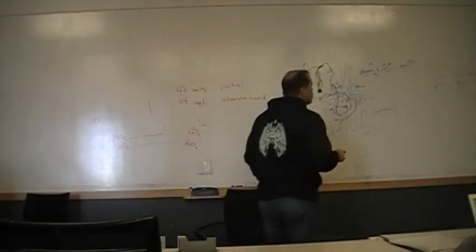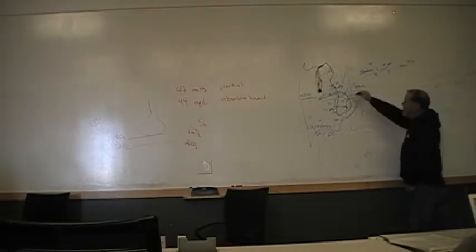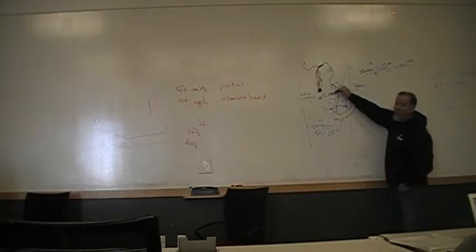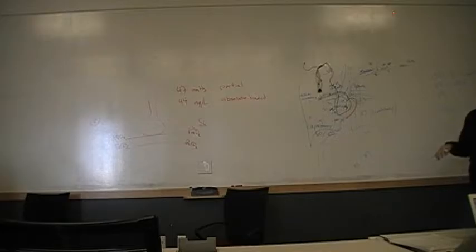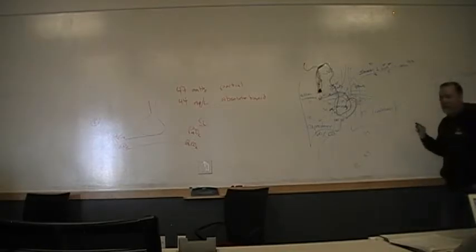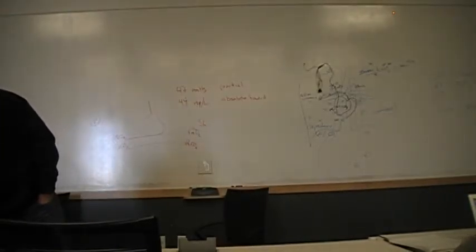So this is called pulmonary capillary wedge pressure, because the tip of that catheter is wedged into a position that prevents blood flow behind it. Okay. So pulmonary capillary wedge pressure should be about 8 to 12. What does Desjardins say? 4 to 12. 4 to 12. 4 is a little low for me.